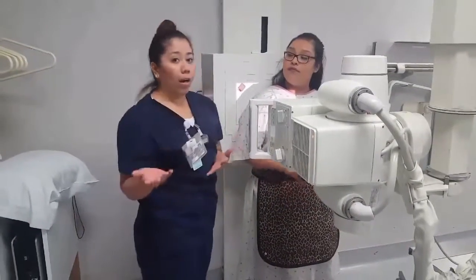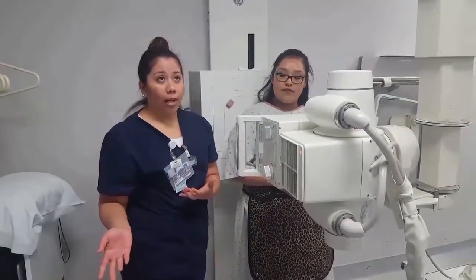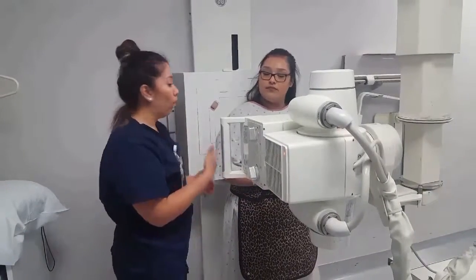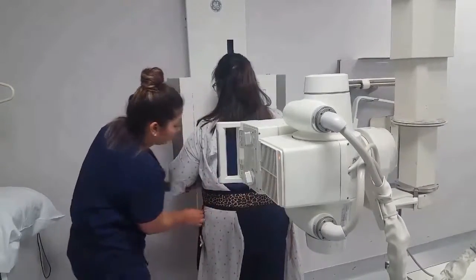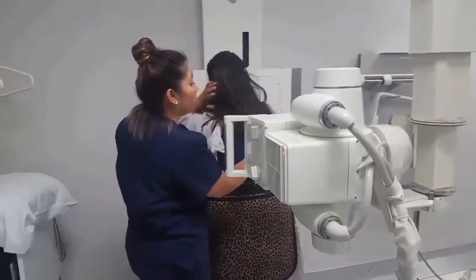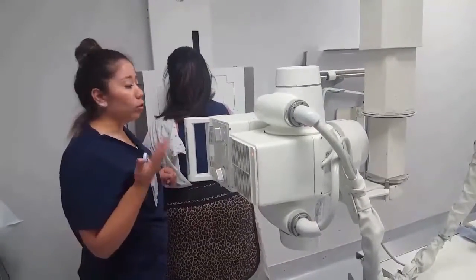Okay, so now our next projection is going to be a PA oblique, which is known as the Y view. And for this, I'm going to ask my patient to face towards the wall bucky. So go ahead and face the wall bucky, and I will be turning my shield around. There you go. So you can stay facing forward, and for this, our central ray is going to be perpendicular to the scapulohumeral joint.